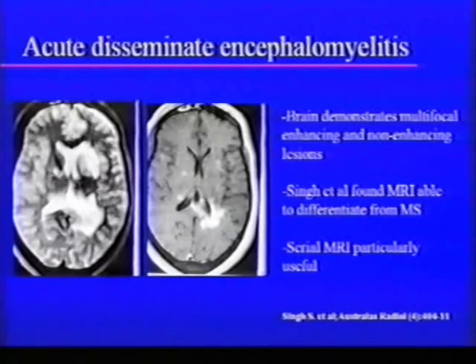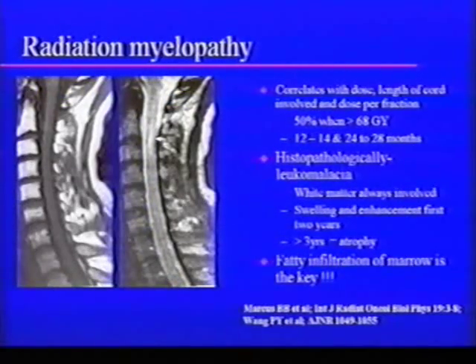Because what you'll see with acute disseminated encephalomyelitis is some of the lesions will start to clear, other ones will start to enhance, and even when the symptoms are still getting better, you can still have new lesions showing up and enhancing. So there's a disconnect between the MR findings and the symptoms. A couple more, and then we'll move on to the next.